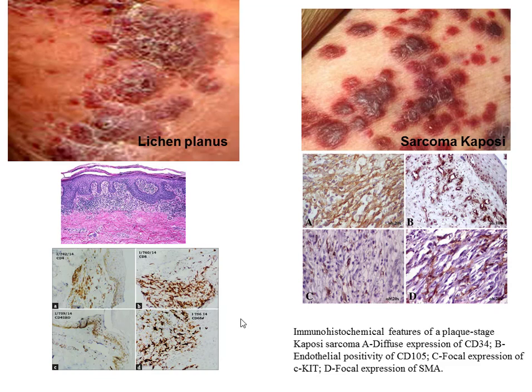When we stain tissue from a biopsy of lichen planus, we will see a positive reaction with CD4, CD8, and CD68, which speaks of a chronic inflammatory reaction in the dermis. In the right picture, in the case of Kaposi sarcoma, these markers will be positive just maybe in single reactive lymphocytes, but the tumor mass will be composed of CD34 positive vessels.